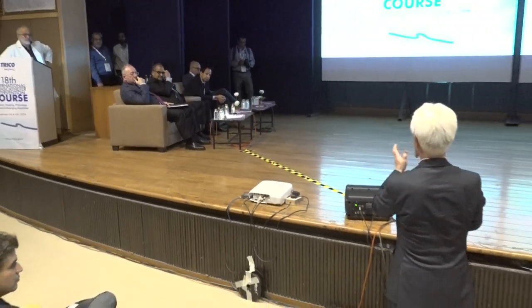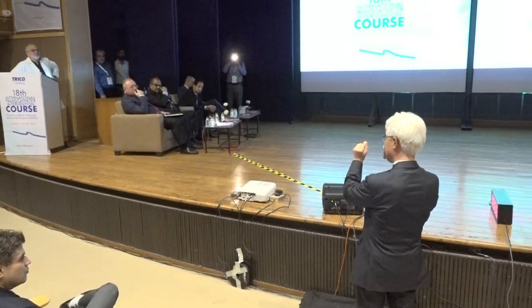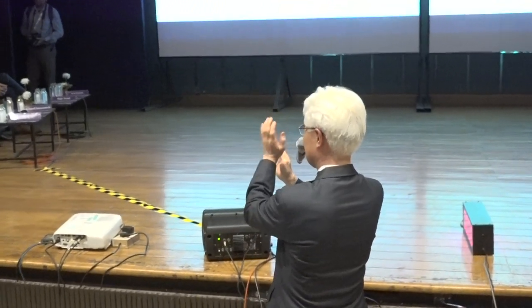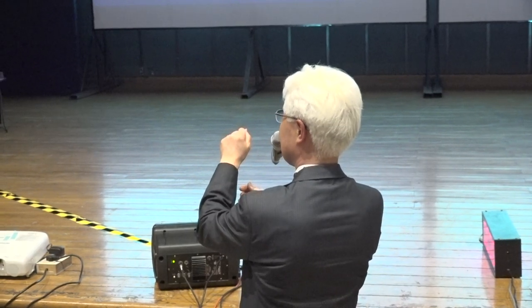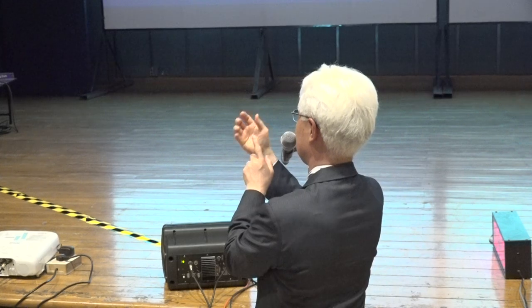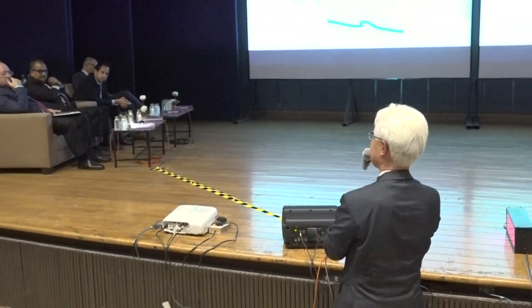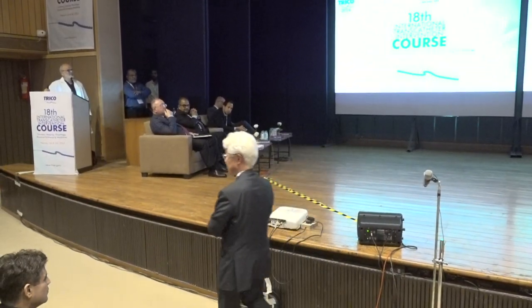To abrade the nodular calcium, wire position is very important. If wire position is very close to the nodule, calcium nodule, you can make an abrasion. But if wire is far from the protrusion of the calcium, it might be very difficult to abrade. That's right. Thank you.